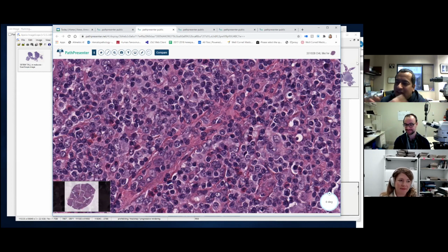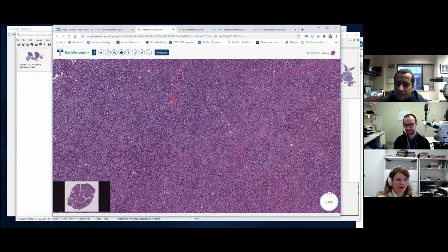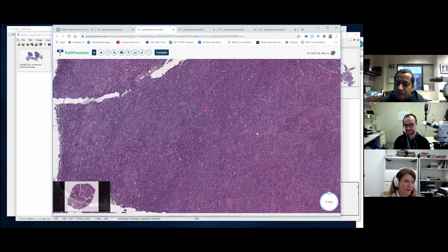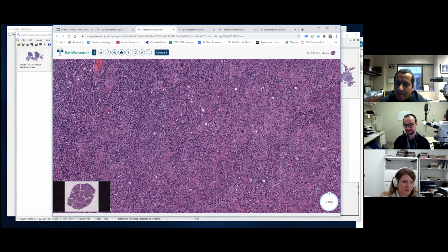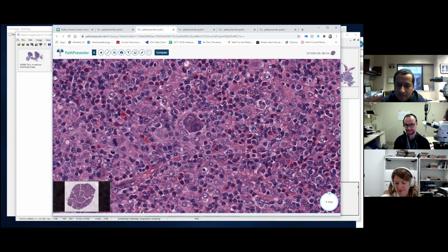If you have somebody presenting with a mediastinal mass, and you have this kind of mixed architecture, and even in this case, from the super low power, we can see these big cells jumping out. This case has particularly striking and particularly large Reed-Sternberg cells. Sometimes you don't necessarily see them on the initial cut, or maybe the morphology isn't that good. Just get a CD30. That's my advice.